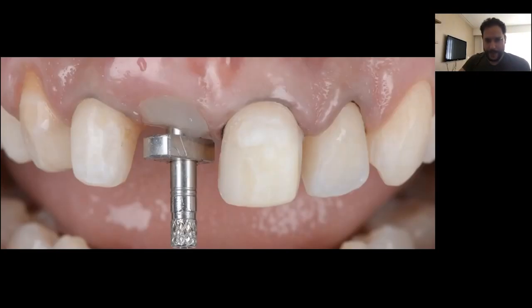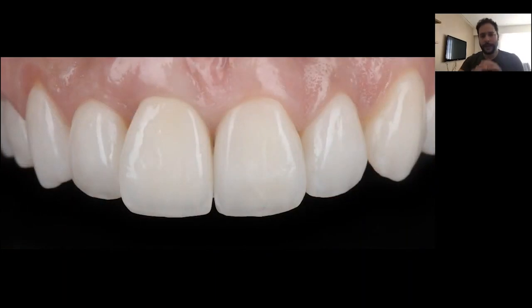This is the result after surgery, and then after the entire healing process, we prepared the adjacent teeth for veneers. This is the complete aesthetic treatment with the implant crown in zirconia, ceramic veneers, and the adjacent teeth — this is a work by Pedro Brito, a very talented Portuguese ceramist.